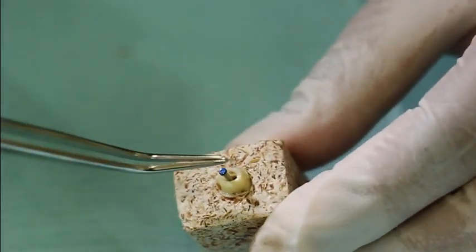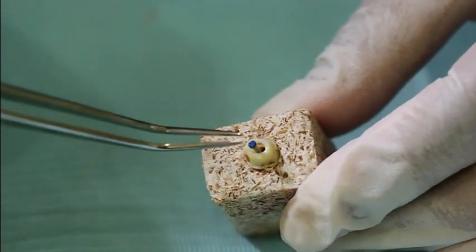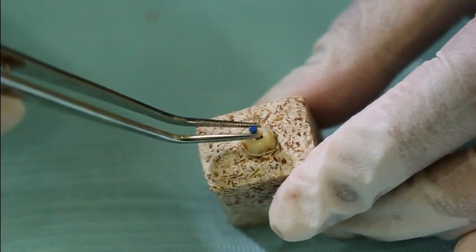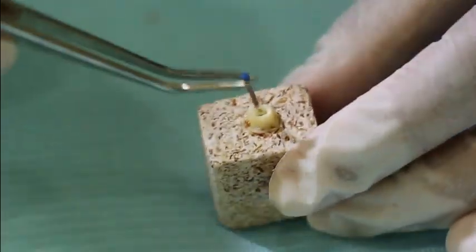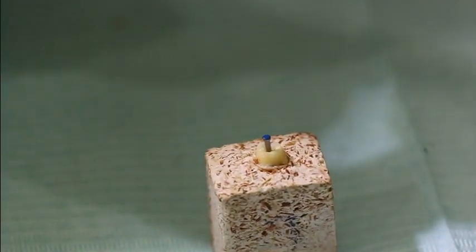If it interferes with the occlusion and you don't have enough room for material, you need to remove the excess of the post.